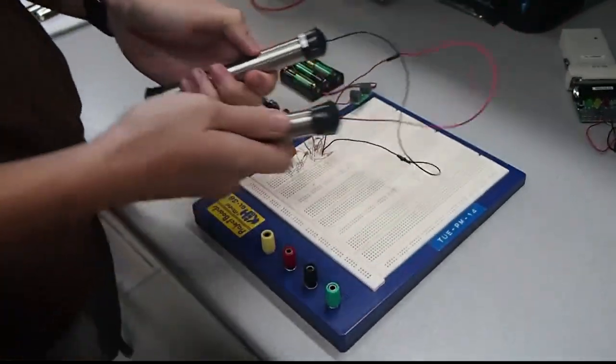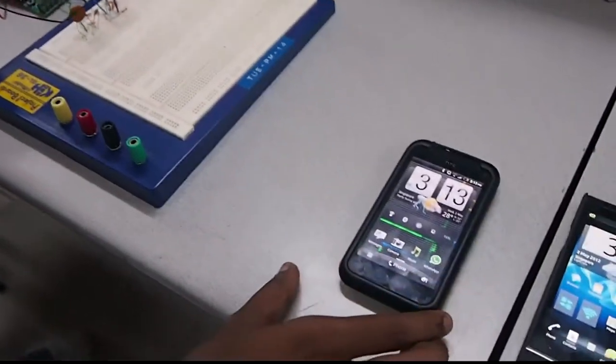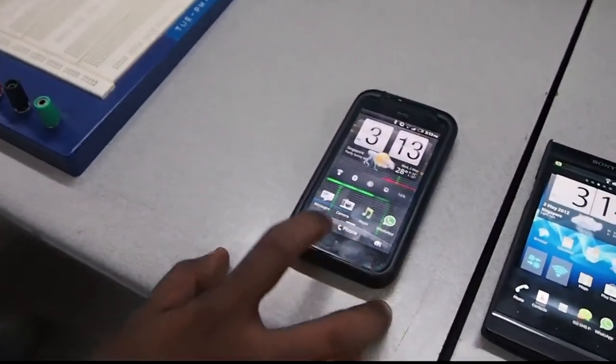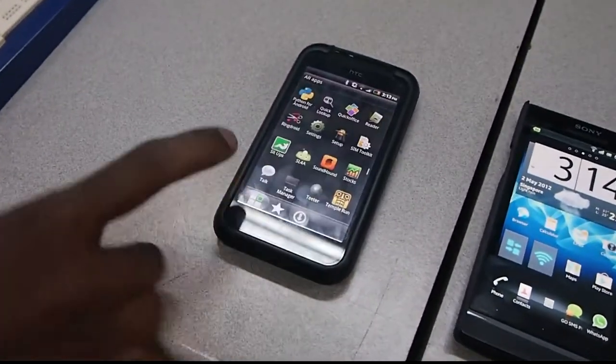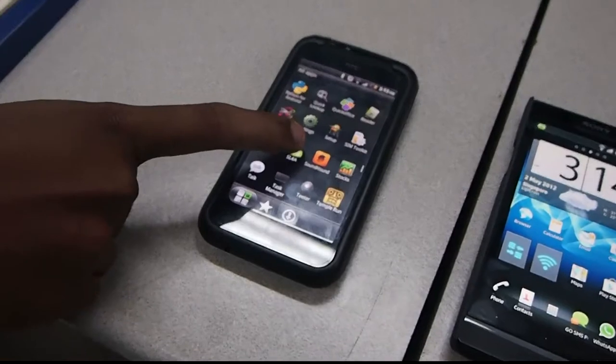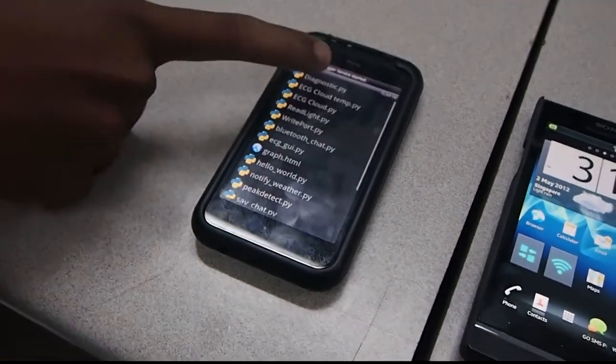Once he's holding onto the electrodes firmly, I'm going to choose the SL4A icon and I'm going to run this program.